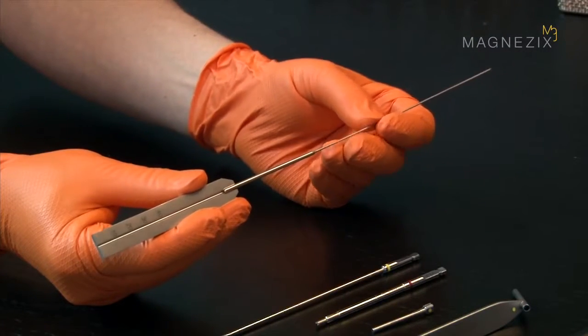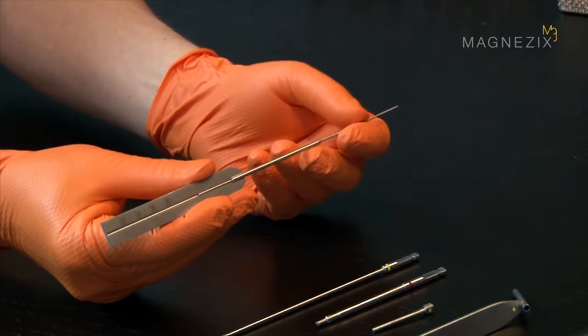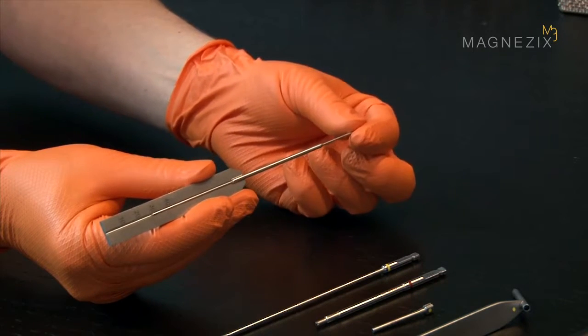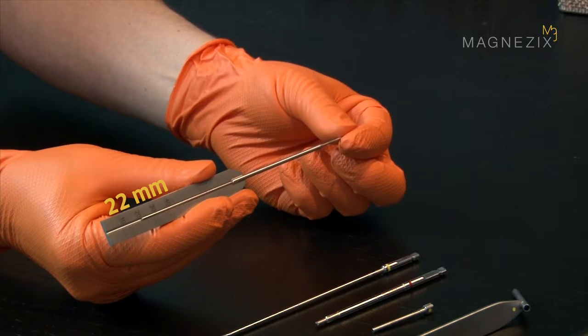To determine the length of the screw, slide the measuring device over the inserted guide wire to the bone. The end of the guide wire, visible in the scale of the measuring device, indicates the length of the screw.